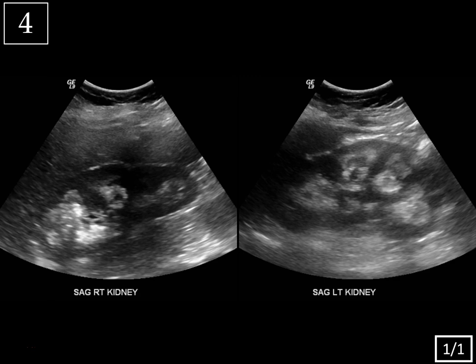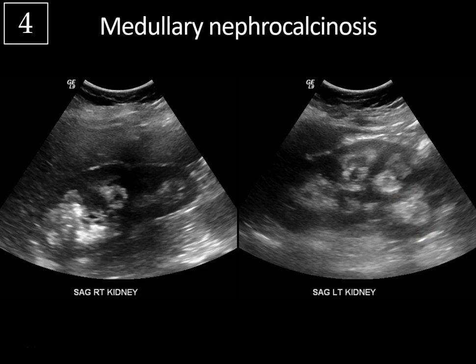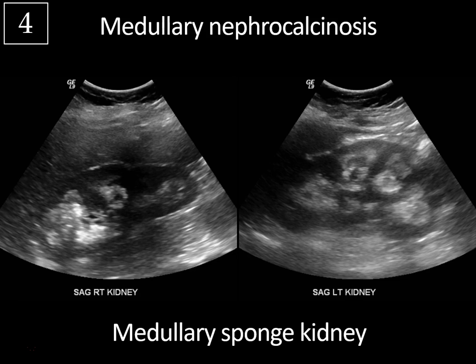Next case, slide one of one. So we're looking at both the right and left kidney, and notice how there are these confluent echogenic triangular-shaped areas scattered throughout the region of the medullary pyramids. It's bilateral, so it's a systemic process. This is typical for medullary nephrocalcinosis, which refers to calcium salts depositing in the medullary pyramids. The most common cause is hyperparathyroidism — about 40%. Anything that causes hypercalcemia can lead to this appearance. This patient had medullary sponge kidney, which is a form of renal tubular ectasia in which tiny calculi deposit in dilated tubules. Another cause is renal tubular acidosis — the type one distal type, which is a familial form.